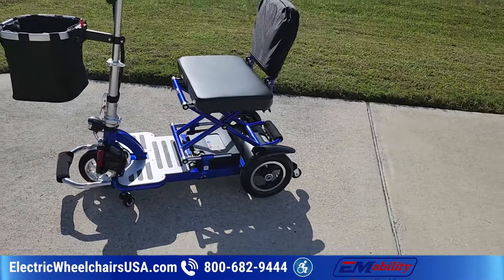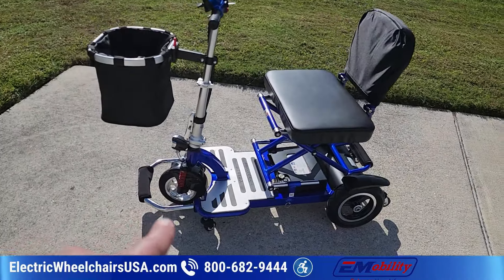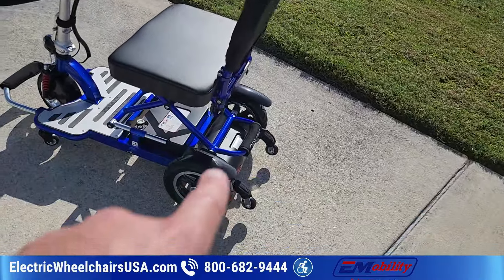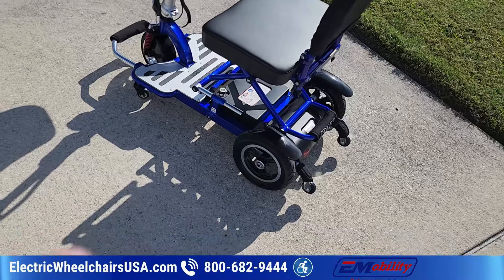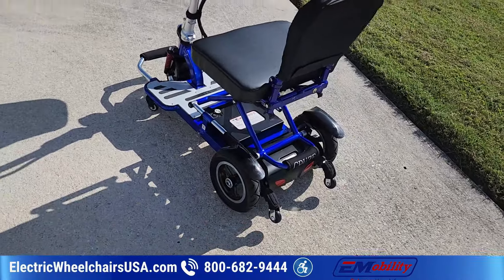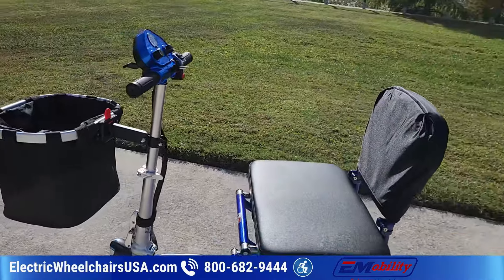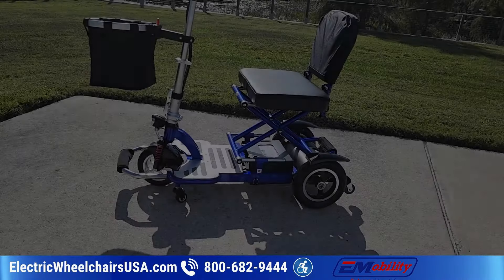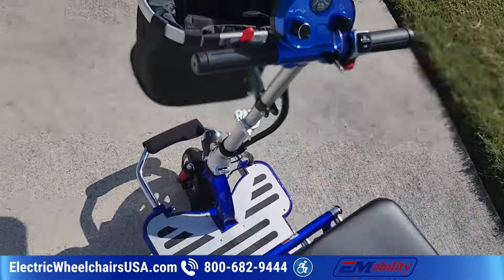A key difference between the two is that the Triax Sport is front-wheel drive, so the motor is in the front wheel, whereas the Triax Cruise has a rear wheel hub motor. Even though this one only goes six miles per hour, it can tackle steeper terrain much better than the Sport. So if you want to take it in a hilly area and don't care as much about speed, this might be a better choice.